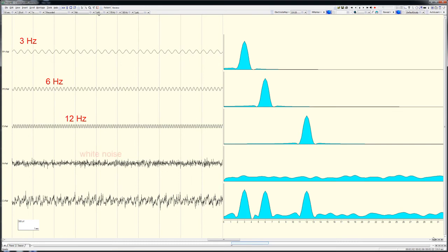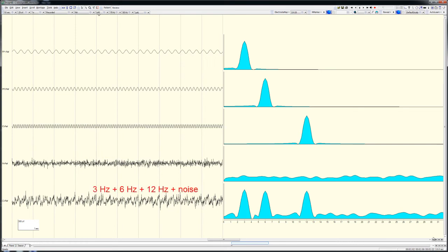The fourth trace is white noise, with an average amplitude of 60 microvolts peak-to-peak. The fifth trace is the mathematical combination of the other four. This trace represents something more akin to an actual EEG signal.